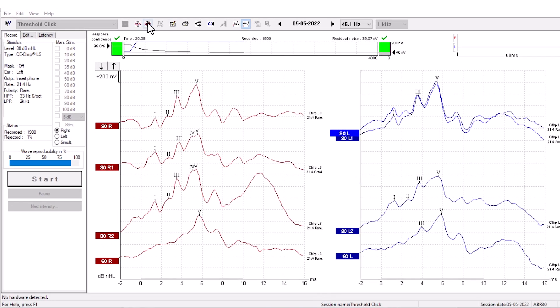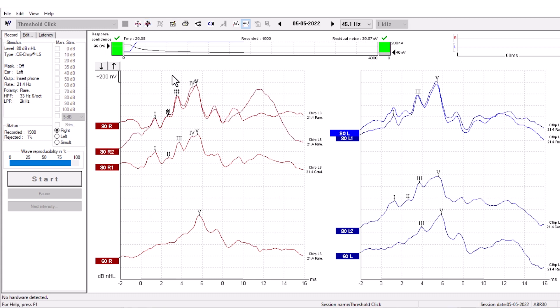This function groups waves that you record with the same recording parameters. If you click it, the curves recorded with CHIRP-LS 21.4 stimulus rate in rarefaction are grouped.